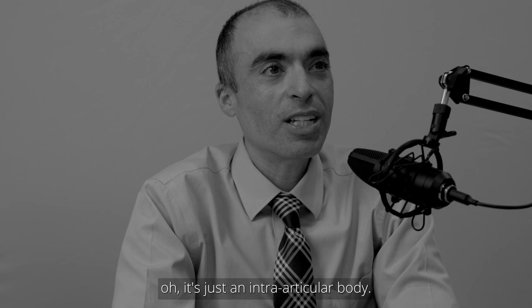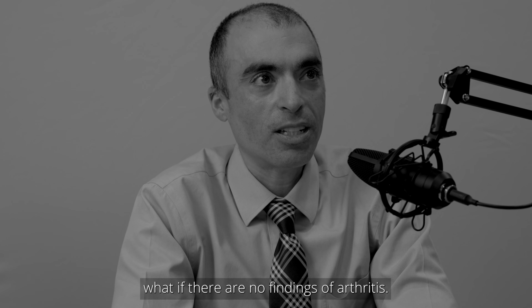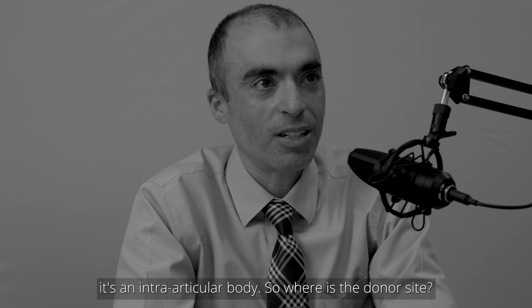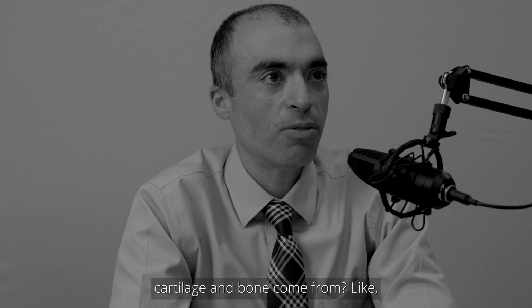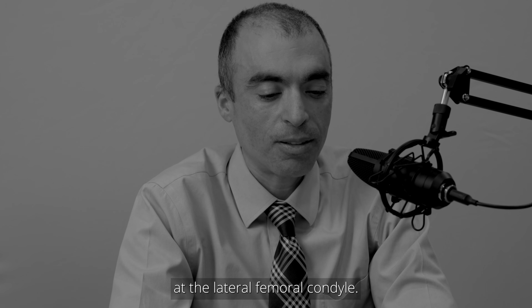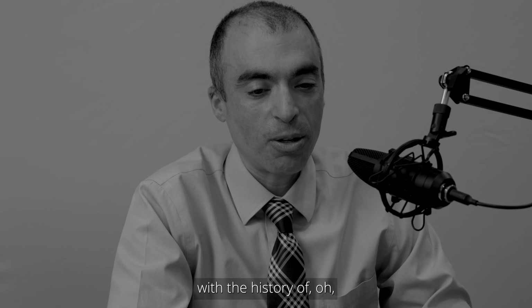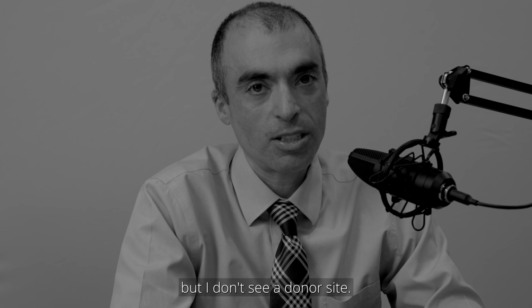So you can think, oh, it's just an intra-articular body. What gets tricky is, what if there are no findings of arthritis, but it looks like an intra-articular body? Because what I first think is, oh, it's an intra-articular body. So where is the donor site? Meaning, where did the piece of cartilage and bone come from? Again, we'll use the knee: it came off the patella, or it came off their distal femur at the lateral femoral condyle. So that's the one diagnosis with a history of an acute injury, and then we see a body, but I don't see a donor site.